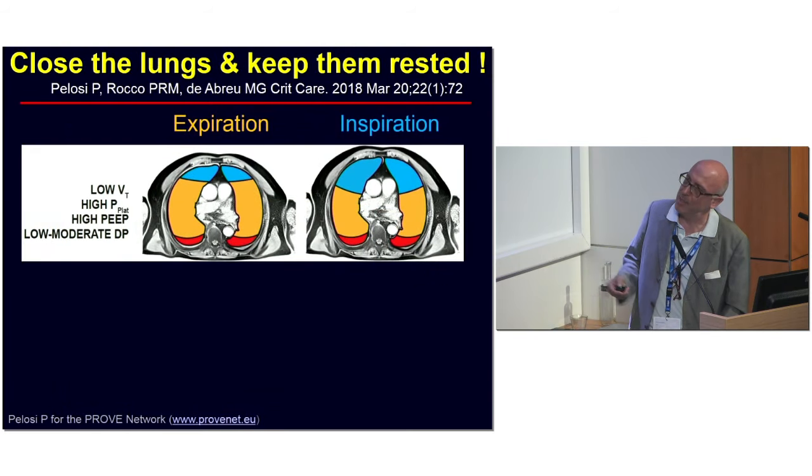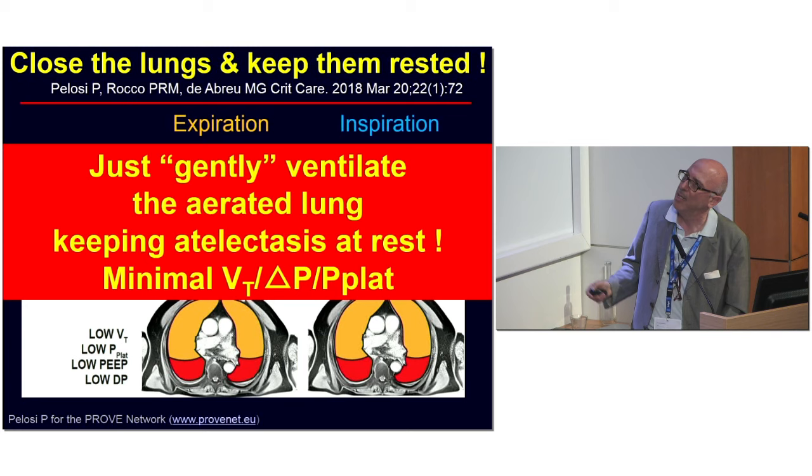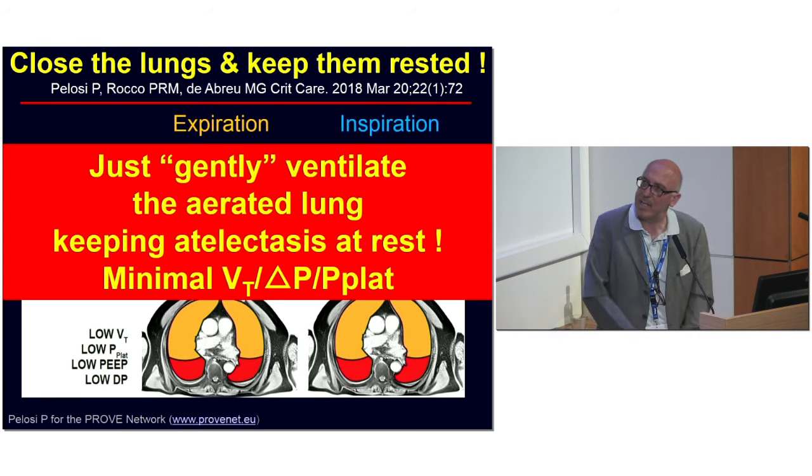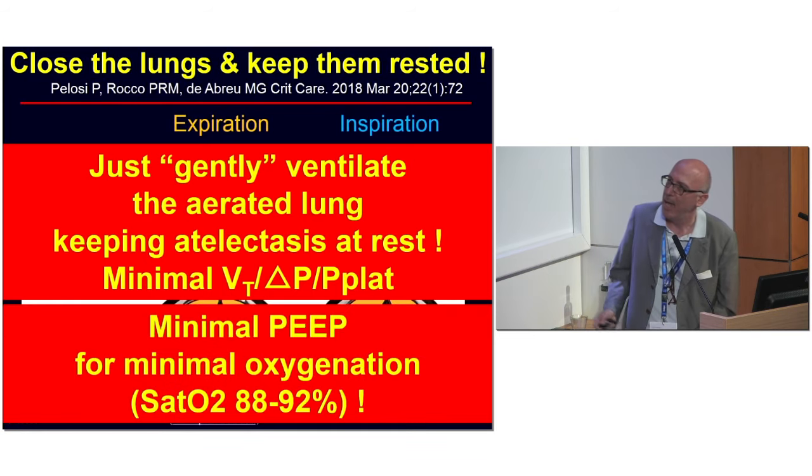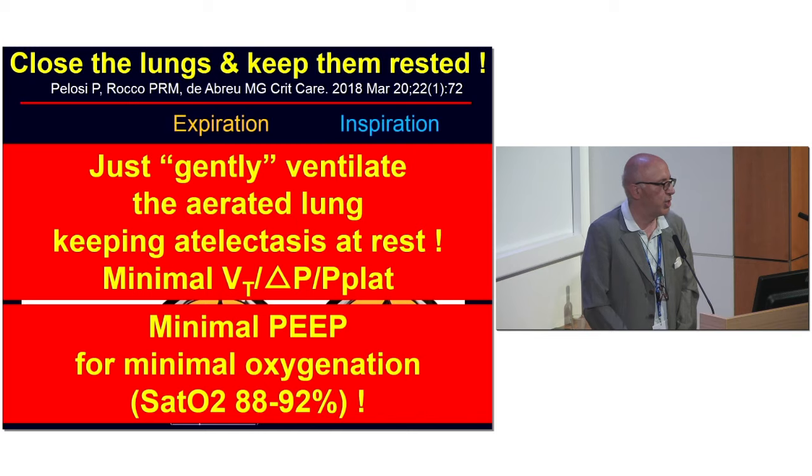So close the lung. This will be discussed later, very easily. Just gently ventilate the aerated lung and keep the atelectasis at rest with minimal tidal volume, minimal driving pressure, and minimal PEEP for minimal oxygenation.